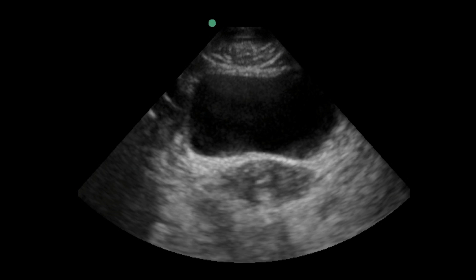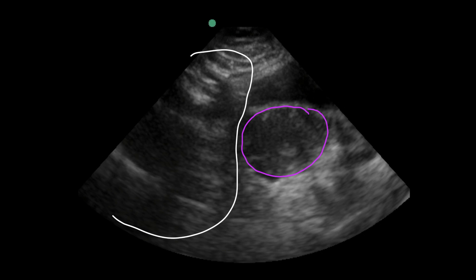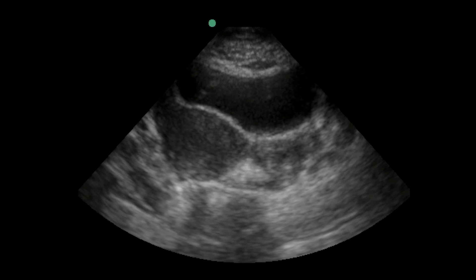After evaluating the uterus in a transverse approach, we want to look at the adnexa. We angle the probe towards the patient's right and can see the uterus on the right side of the screen, allowing us to examine the surrounding area for anything abnormal. In this image we do not see any adnexal masses on the right. When we look at the left side we again see the uterus, but there's an area that looks different and is concerning. Right now we can't definitively say what that is, so we need to evaluate further with a transvaginal ultrasound.